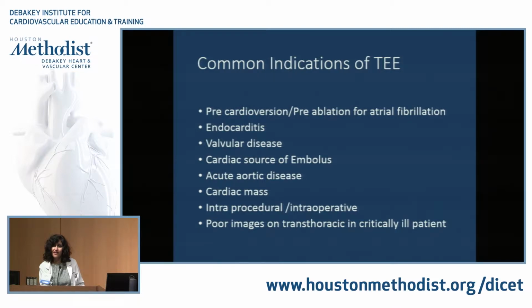We can do it bedside, and of course, we can do it in cath labs, holding areas, and in our designated suite. So what are the most common indications for TEE? In our own lab, in an annual year, about 5% of our echo imaging studies are TEEs, of which the top diagnoses are atrial fibrillation, endocarditis, and valvular disease, and now increasingly intraprocedural TEEs.